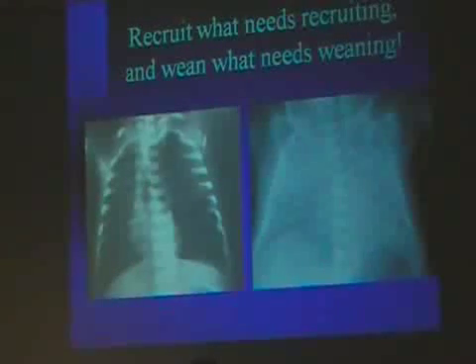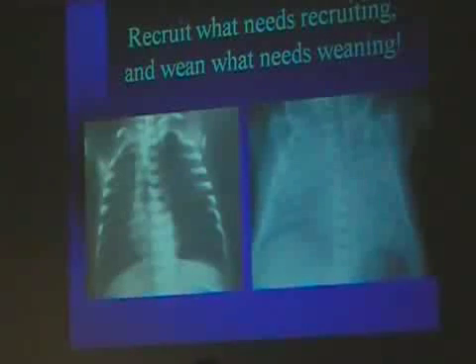The only way I'm going to know that is sit down and watch my FiO2 as I change my mean airway pressure. Managing oscillation correctly is time intensive. Until you get the kid very stable and where you want him to be, it's time intensive. The lung is a changing dynamic organ when you've got this kind of thing going on. And just walking away is how we get into trouble. That's how we get into trouble.